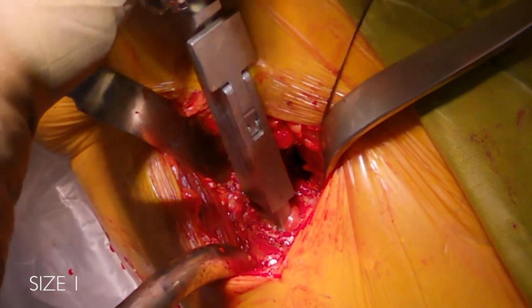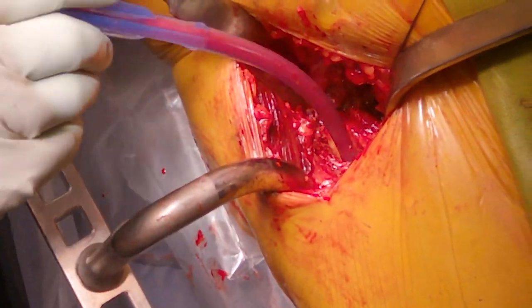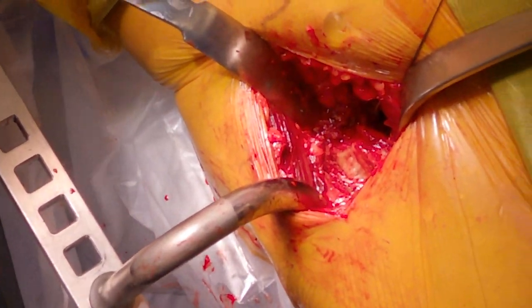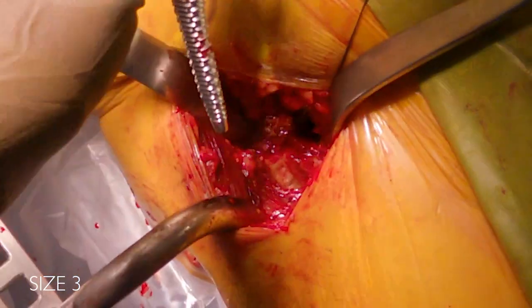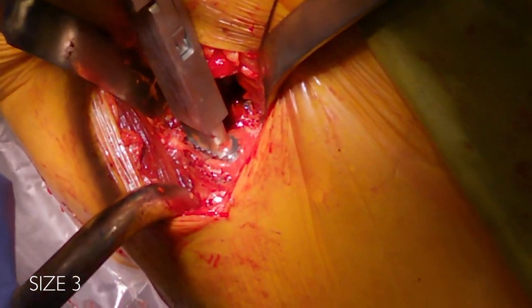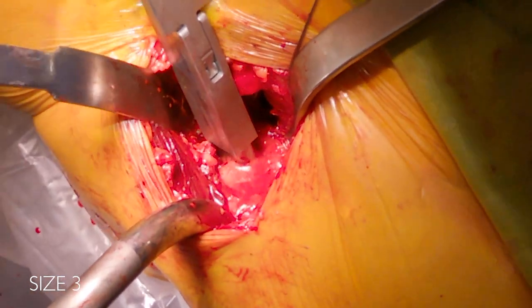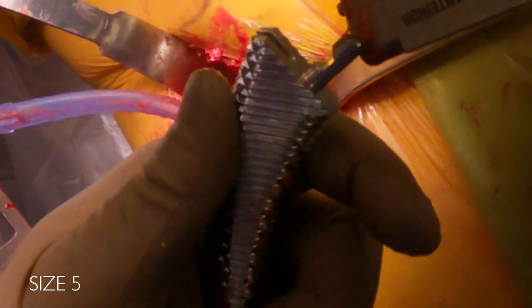With the Concise system, you can pretty efficiently go up broach sizes — I typically skip broach sizes. This patient was templated for a size seven, and this is a size three going in now. My staff knows that if I templated an odd number such as seven, to give me starter broach, one, three, five, seven. Here's the five.